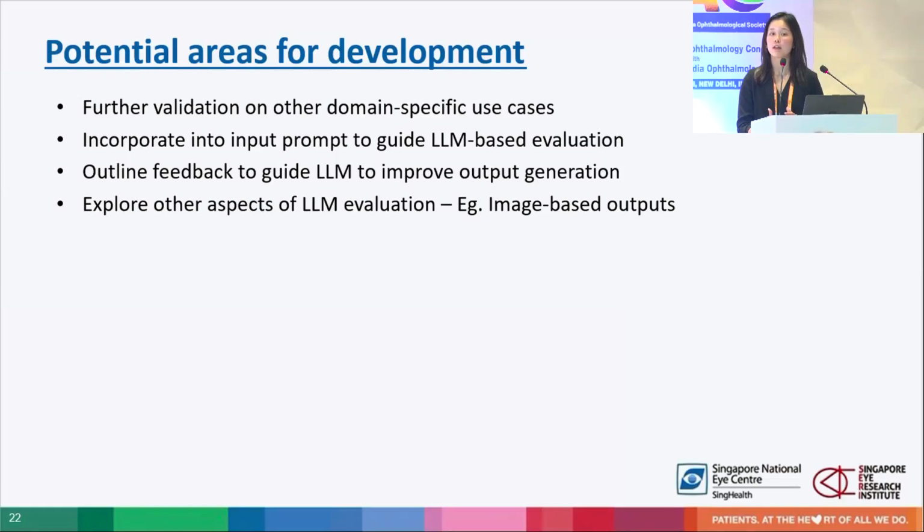And this can serve in a potential hybrid model where it can serve as a first pass before the clinician has a closer inspection on the gradings to have better insights and more efficient evaluation.